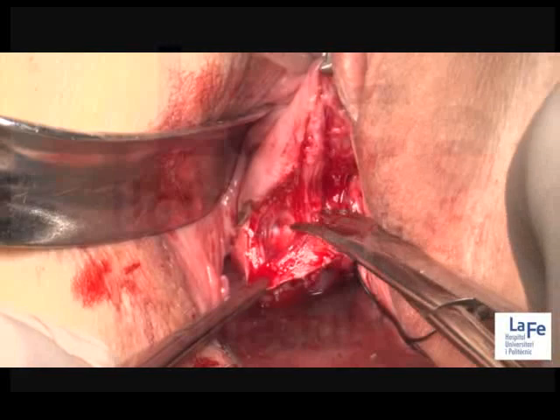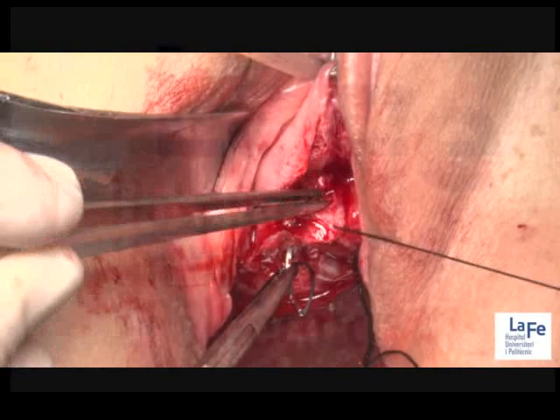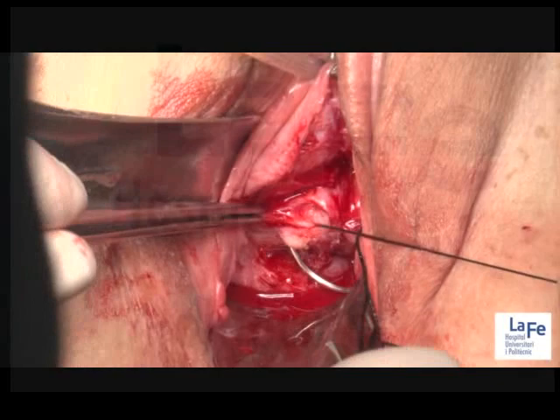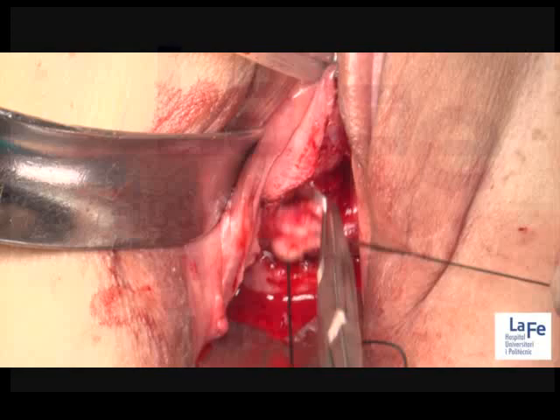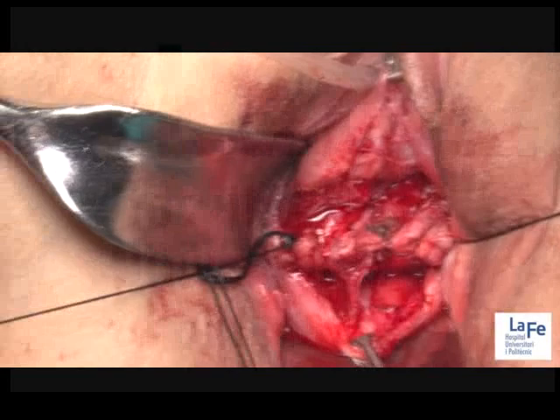The use of a uterine manipulator may condition tumor spillage due to erosion and squeezing of the uterine cervix, and even tumor perforation. Additionally, intraperitoneal colpotomy may lead to pelvic contamination by the tumor. These protective maneuvers have been demonstrated to diminish the rate of relapse in a recent study entitled SUCCOR. Notwithstanding, prospective studies are needed to elucidate this finding.